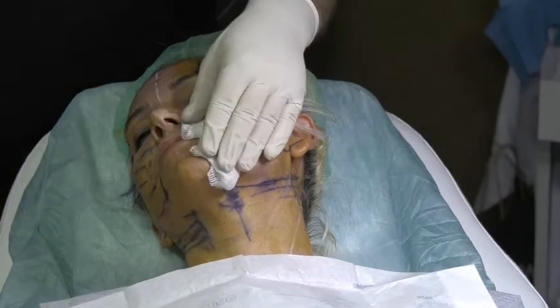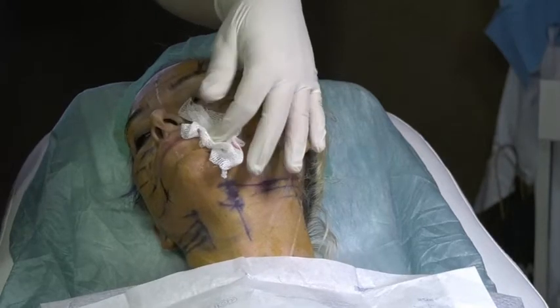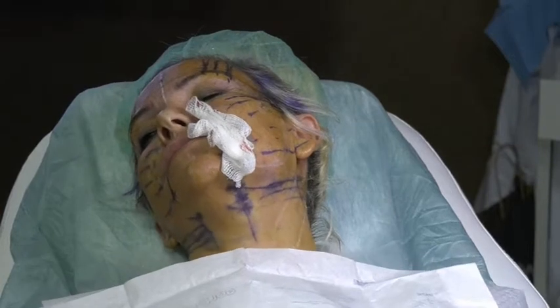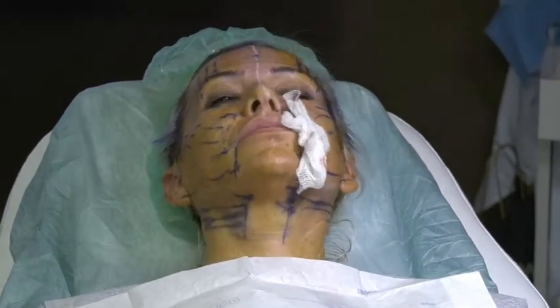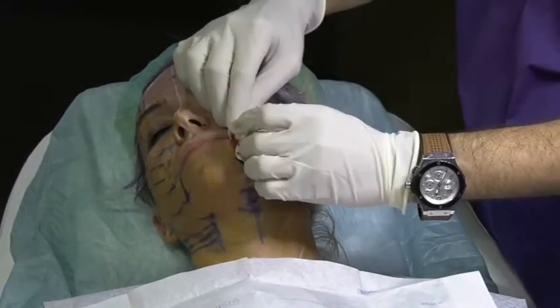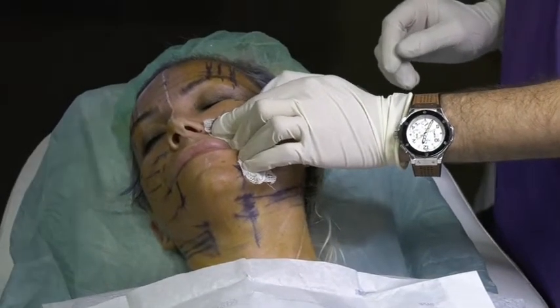Inserting the threads in the face, in the neck, in the eyebrow is 3 stages. Stage 1, stage 2, stage 3. Stage 1 is to enter and take subcutaneous level. Stage 2 called drive with soft support. Stage 3 is the fixation. So, let us do the 3 stages.